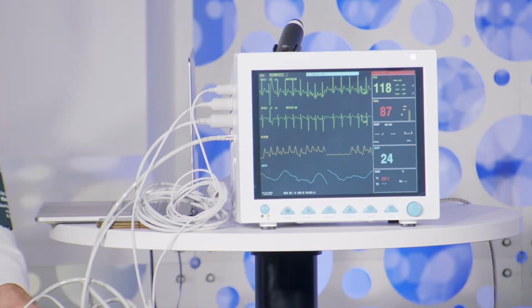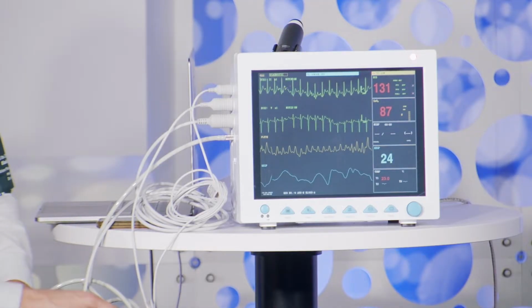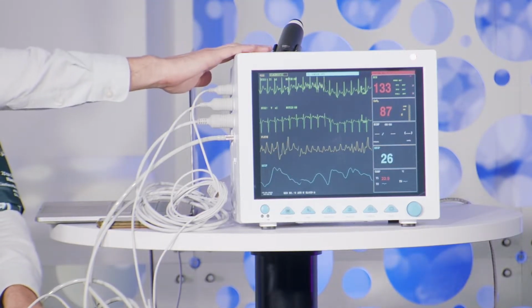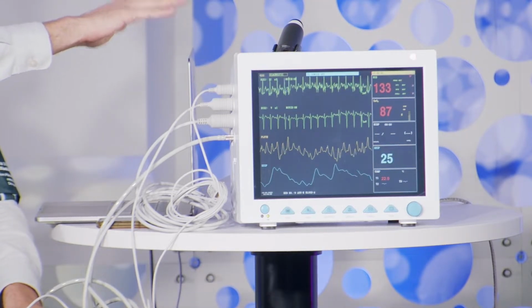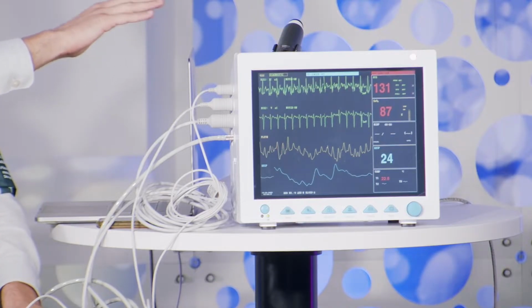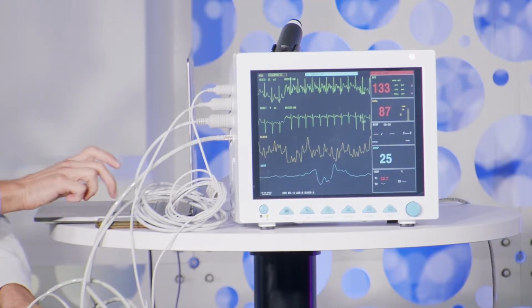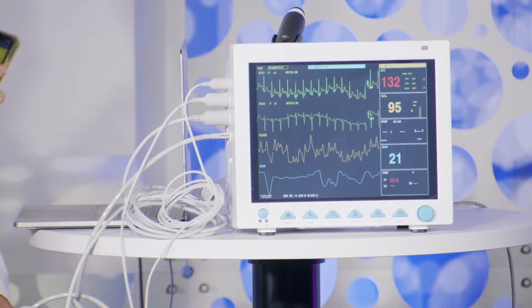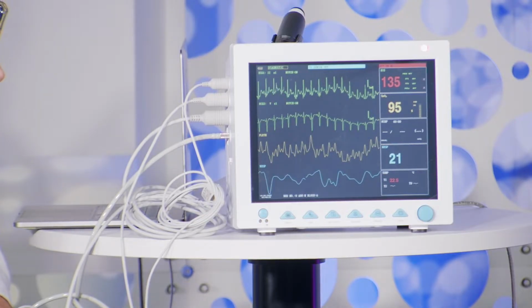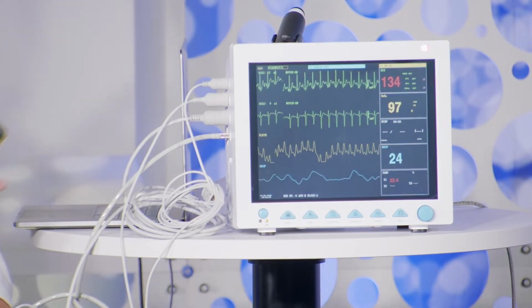So I'm going to explain a little bit about the setup that we have here. As you can see, I'm all hooked up. What we have here is the patient monitor. We already hacked it, so it runs a customized backdoor that we created just for it. Not only did we create a backdoor, we also created an iPhone app to control it. This is the iPhone app. You can see it on the screen. If I move this, it's mirroring on the screen. This is a completely working iPhone app that controls a customized backdoor running on the patient monitor.